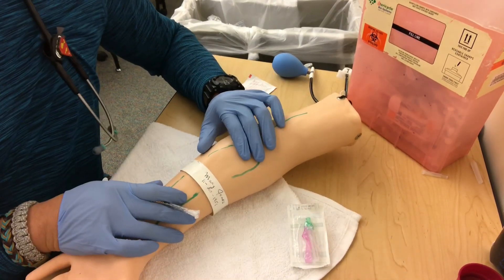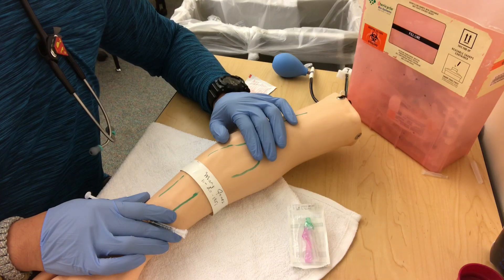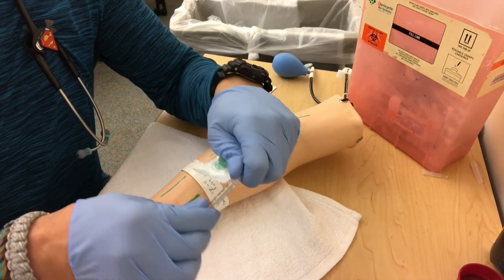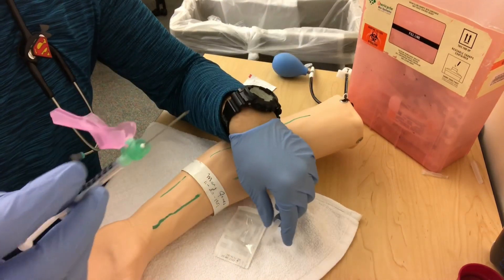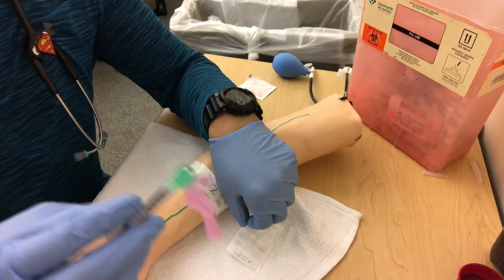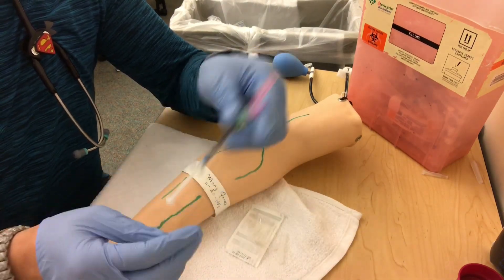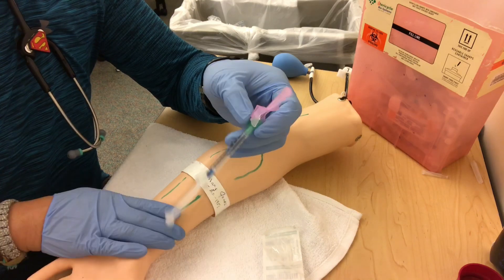I don't have a groin to show you, but the femoral is pretty easy to find. Usually in code blues when we're checking for a central pulse — we get the carotid and we have the femoral. The femoral is a good target. I recommend getting a longer needle for femoral — they have a one-and-a-half inch needle that you can use with the same syringe. If you've got a thick patient, you need the extra length. The femoral bounding pulse is hard to miss — just go straight in, you don't need to angle it. You'll need to hold pressure a bit longer than the radial, and get someone to help you.